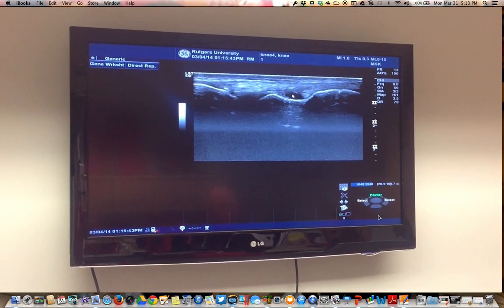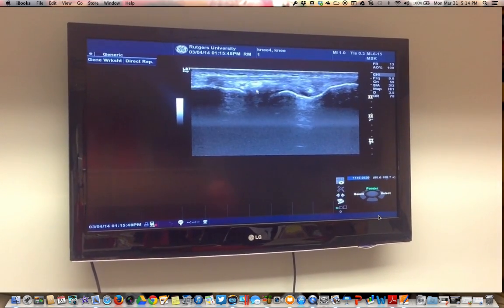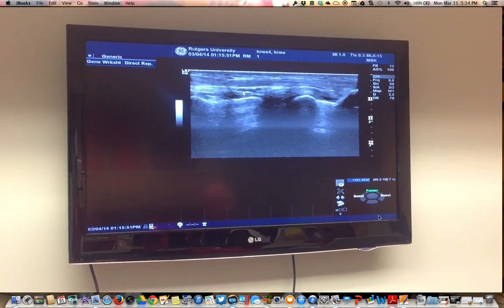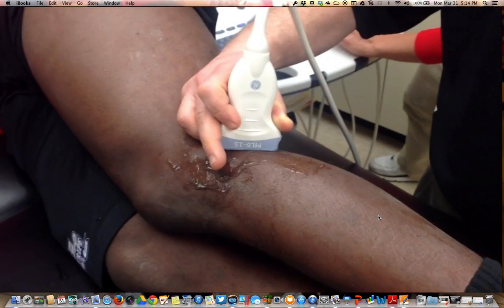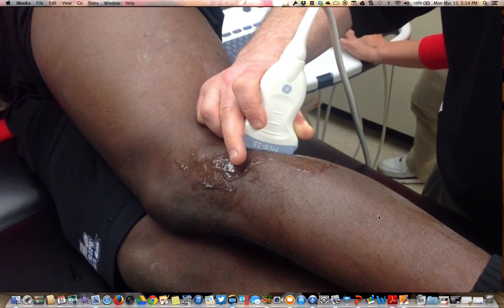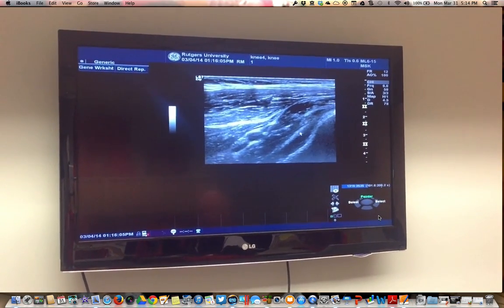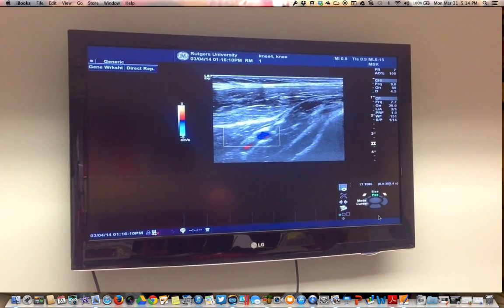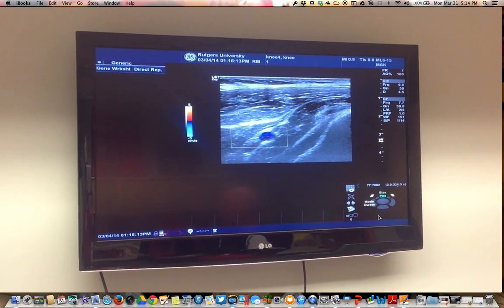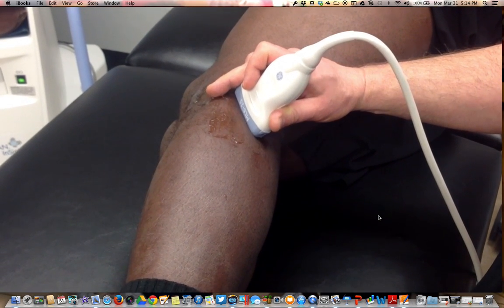We will focus on following this tendon out as it comes back over the joint, running here, and then it will be difficult to follow, and we'll have to make a turn as it runs oblique, and we'll change our depth down, and we'll follow that muscle as it comes down right here, directly above the femur in the posterior aspect, and then we have the popliteal artery, which sits above it. Note the probe position of the very deep oblique angle that we're looking at. It's a very oblique angle that we use to follow that tendon up and around in this fashion.